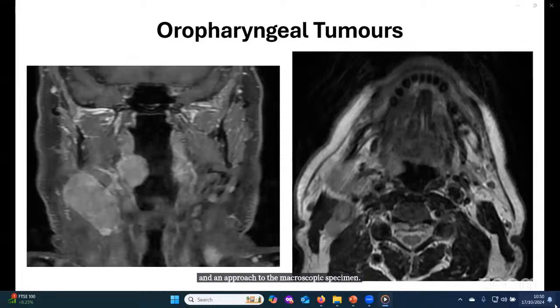The left image reveals a tonsillar carcinoma highlighted in orange and a corresponding ipsilateral metastatic lymph node. Unlike CT scans, MRI provides excellent contrast resolution to assess extrinsic muscles of the tongue, and this area here represents the hyoglossus muscle, which is indicated in green.